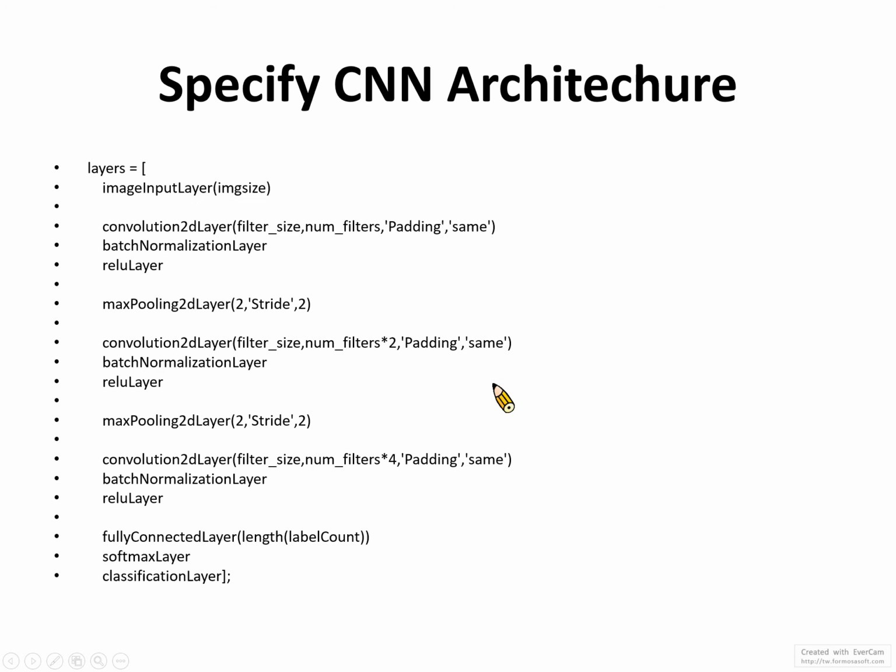Okay, so this is the CNN architecture we built, followed from the digit classification examples. In this CNN architecture, there are only a few layers. These layers include three convolution layers and max pooling layers.